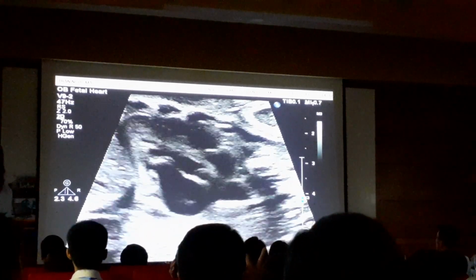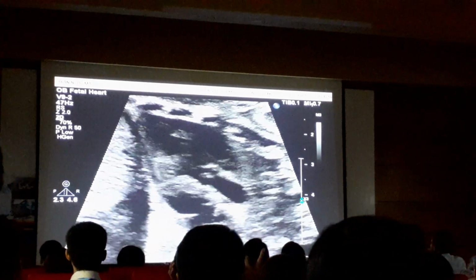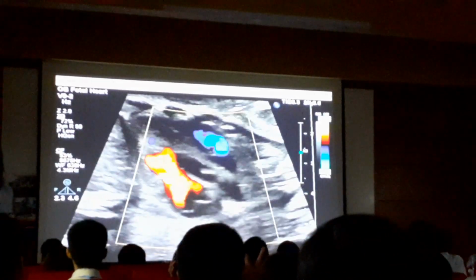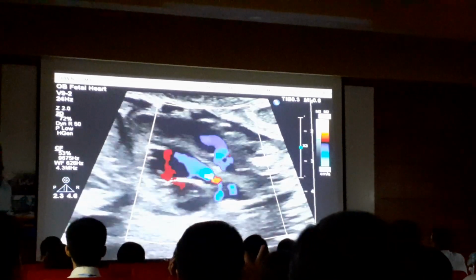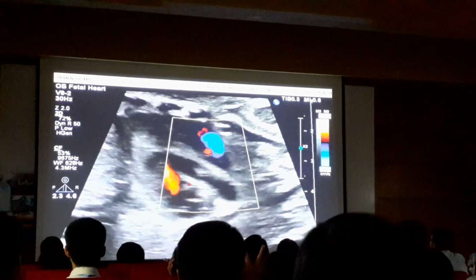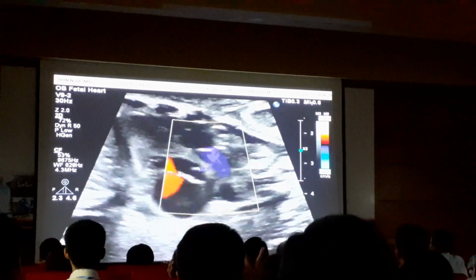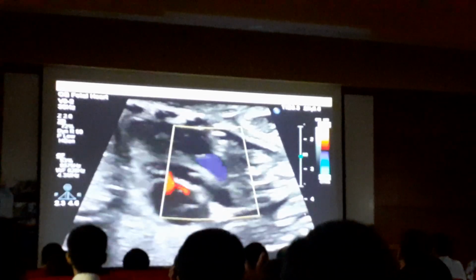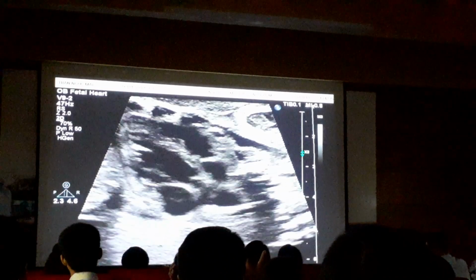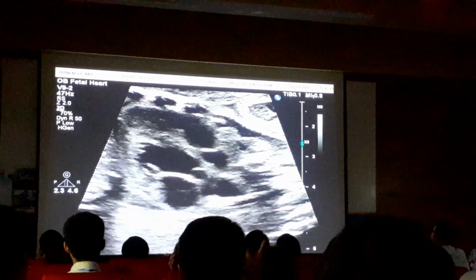So this will allow us to again look at the pulmonary valve. Doppler. Color Doppler. Could do the spectral Doppler again, slightly better angle. But what I really want to do is measure.